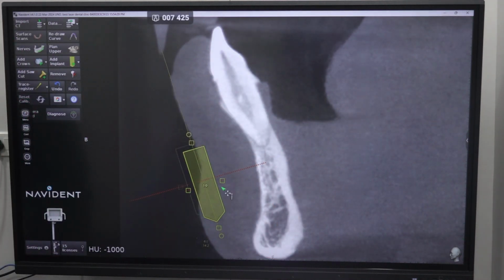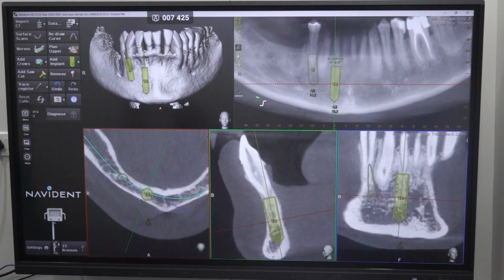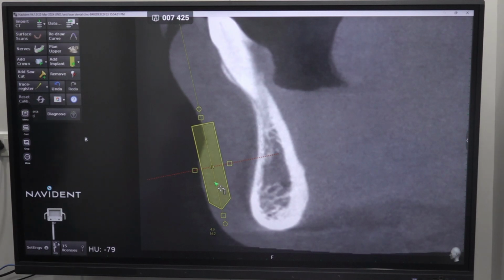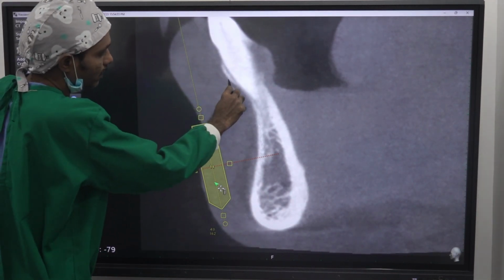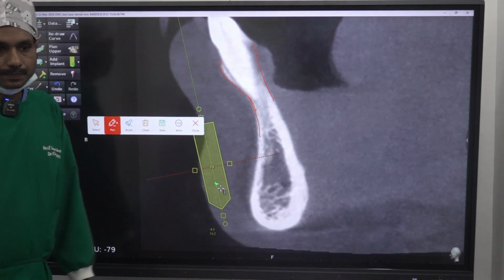you will see. So 3.5 mm will be better, right? We can go till the lower border. KOS are compression screws. This is 3-2. Here it is much worse. This is called hourglass shape, right? It is coming like this, no? There is a constriction here.